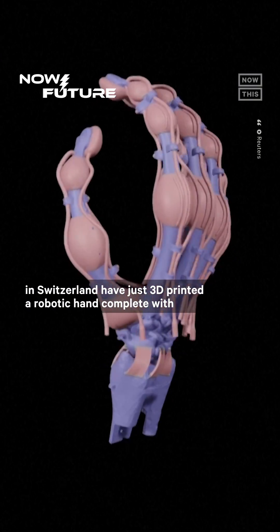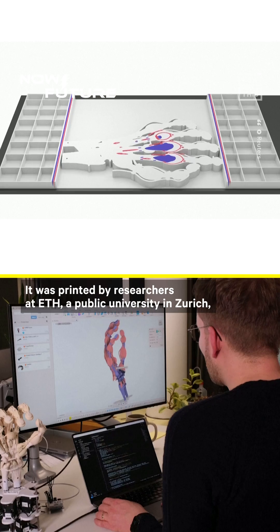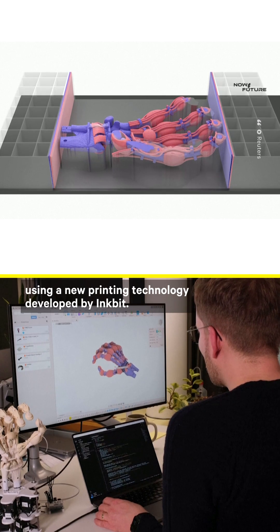You gotta hand it to them. Scientists in Switzerland have just 3D printed a robotic hand complete with bones, ligaments, and tendons. It was printed by researchers at ETH, a public university in Zurich, using a new printing technology developed by Inkbit.